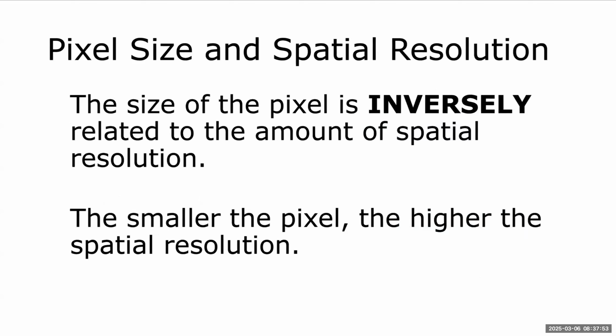When we think about pixel size and how that's related to spatial resolution, remember that the size of the pixel is going to be inversely related to the amount of spatial resolution. So the smaller the pixel size, the higher or the better the spatial resolution. So smaller pixels give you better spatial resolution.